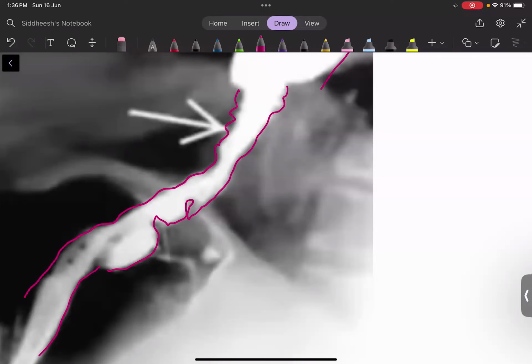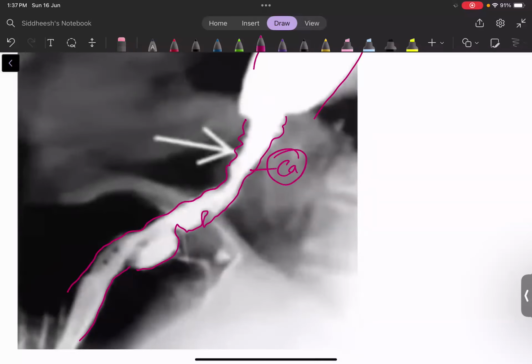In any image of CT, MRI, I am not sure for the pathological features, but I am sure for the radiological features: if you see irregular patches or an irregular surface, always think of cancer. If a radiological image shows something irregular here and there, irregular shape and size, always think of the presence of cancer.